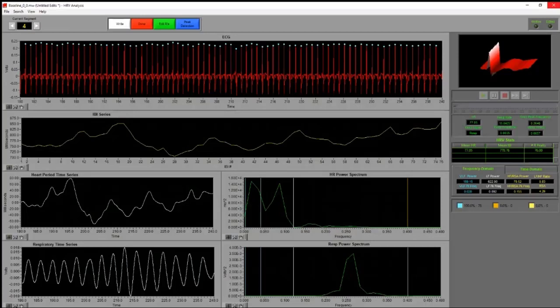Okay, and then I got some questions more about the hardware collecting these data. So for the mobile data, what do we sample that at? The MindWare Mobile is a 500 hertz device, so that means that it samples the data at 500 times per second. The wired unit that MindWare has, we call it the BioNex. That's the desktop amplifier that you might have. That samples natively at usually every channel at about 1 kilohertz, or 1,000 times per second.